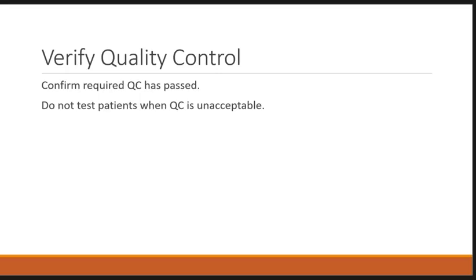Prior to beginning the testing on the patient, the nurse should confirm that all required quality control procedures have been successfully completed and documented according to institutional policy. Patient testing cannot be performed if QC requirements have not been met or if the instrument is out of compliance.